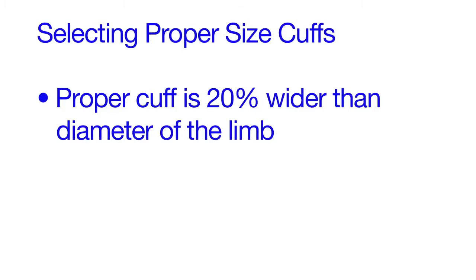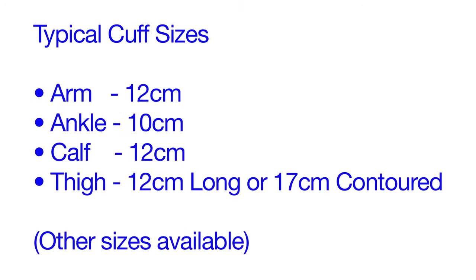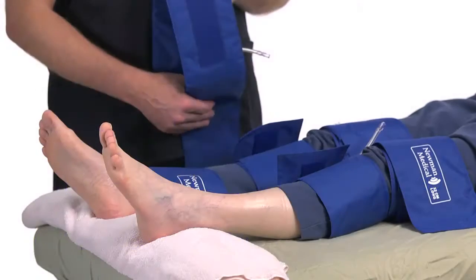Wrapping cuffs correctly will make exams easier and results consistent. Select the proper size cuff, about 20% wider than the diameter of the limb. Typically, 12 cm cuffs are used for the arm and 10 cm for the ankle. 12 cm cuffs are used at the calf, and 12 cm long or 17 cm contoured cuffs may be used on the thigh. Newman Medical offers additional cuff sizes for different sized limbs. Small digit cuffs are used for the toes.